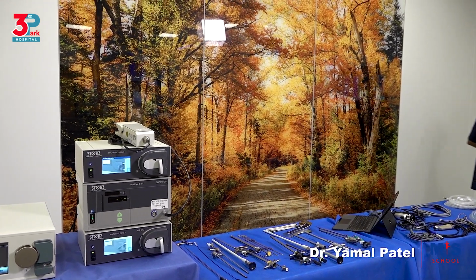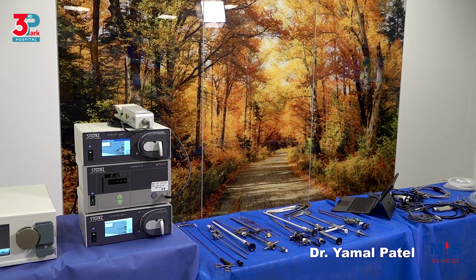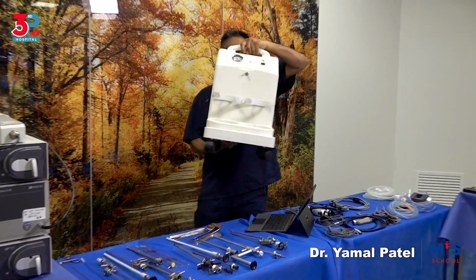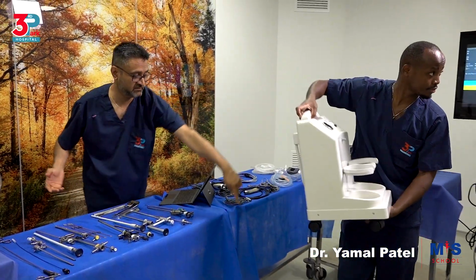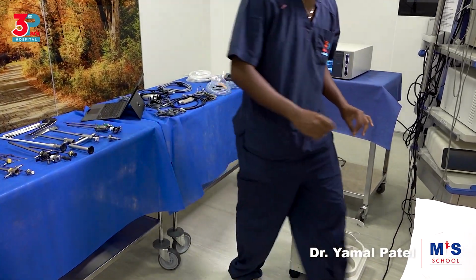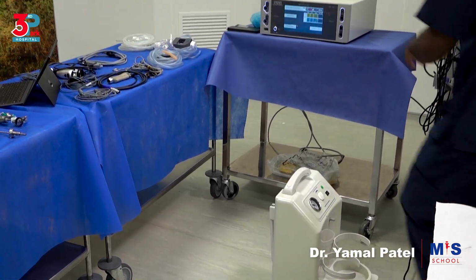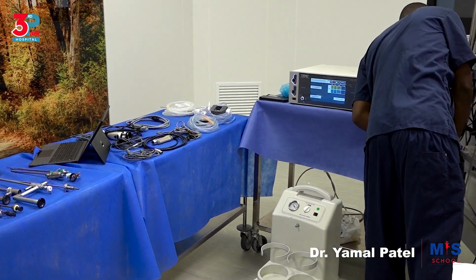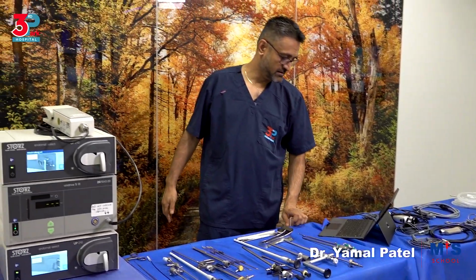If we can just bring the suction machine back in front. So this is how you would set up. Put it down here. All right, so the suction machine, and you may have an energy source. In this case, that's the energy source that we may use for surgery that involves electrosurgery.